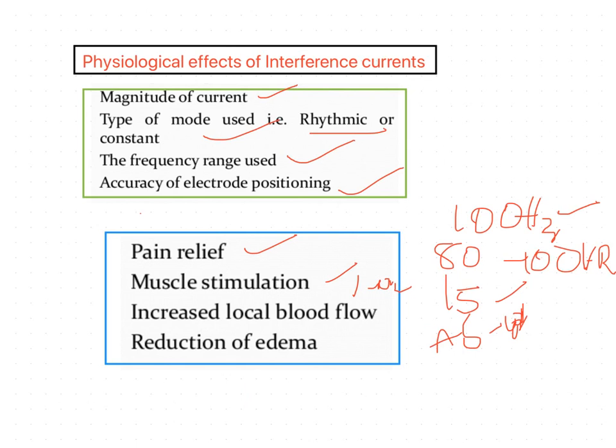A complete range of all these types of muscle contraction can be seen when a rhythmical frequency of 1 to 100 Hz is used. Muscle contraction is produced with little sensory stimulation and can be of deeply placed muscles, for example, pelvic floor muscles.